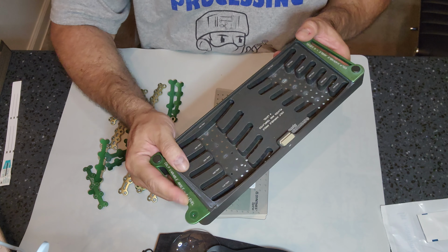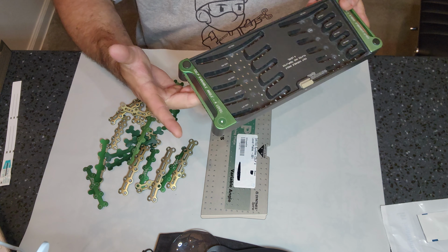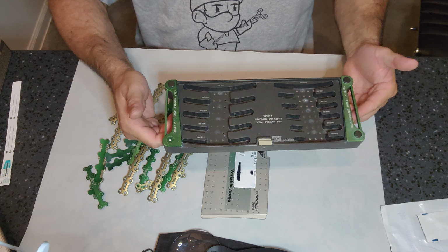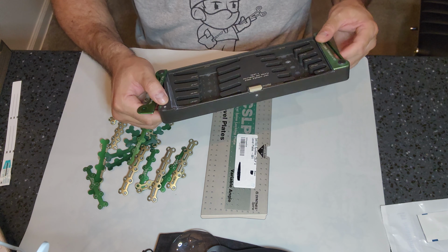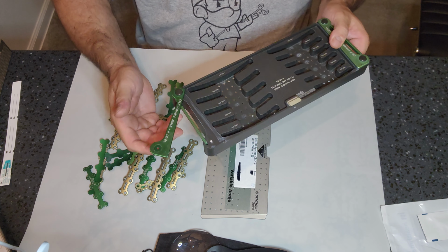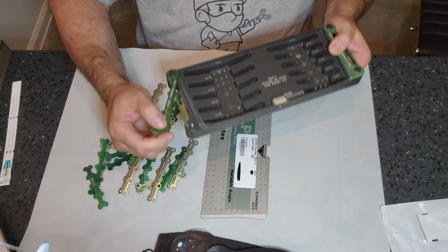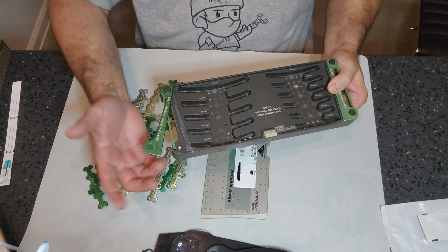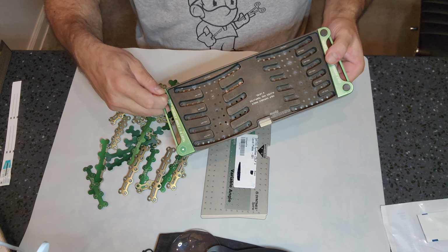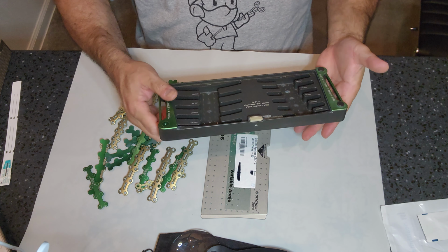So this is a damaged container. Not too bad, but honestly, if this is a loaner, you should report that. If it's a house tray, you should look to getting this fixed, right? That's unacceptable. This can get caught on something and break off, or a sharp edge right there can cut into the container, the wrapping material. So you should get that fixed. It's a very easy fix. You can probably order that little screw from the manufacturer and get that fixed.